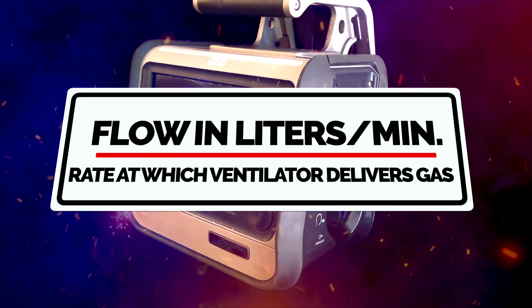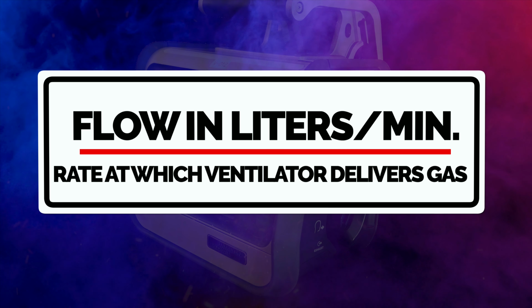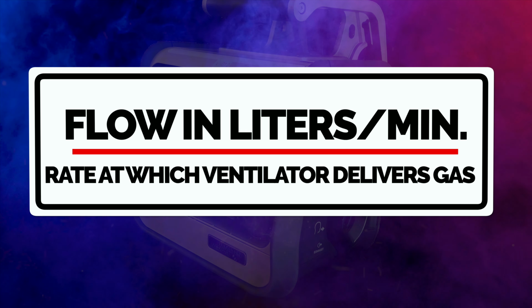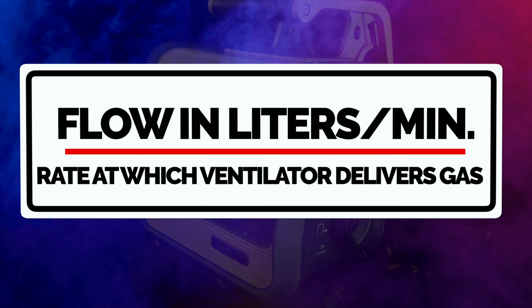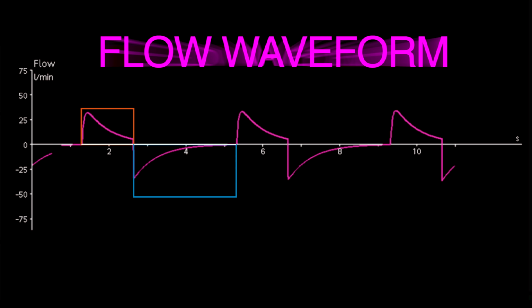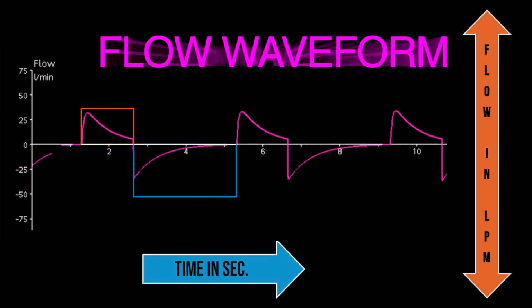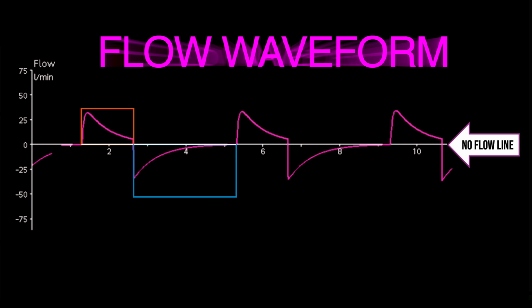Flow, measured in liters per minute, refers to the rate at which the ventilator delivers a volume of gas to a patient during inspiration and the rate at which air exits during the expiratory phase of the breath cycle. The vertical axis indicates flow and the horizontal axis depicts the time in seconds. The middle line in the graph, labeled 0, separates inspiration from exhalation and is the no flow line.